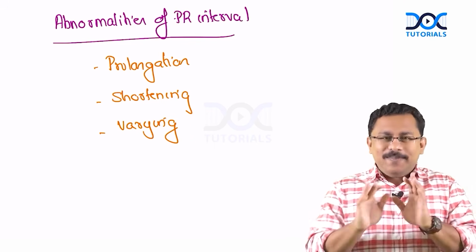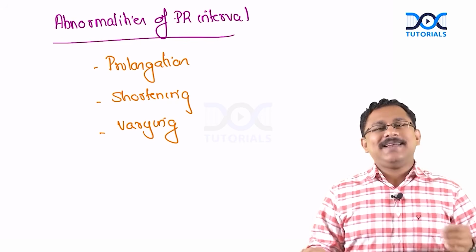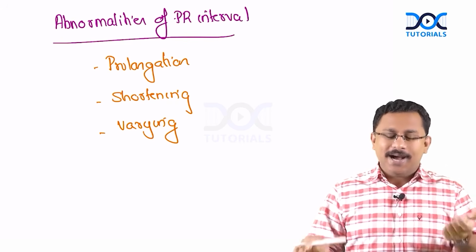One basic point is that the PR interval is also dependent on the heart rate.